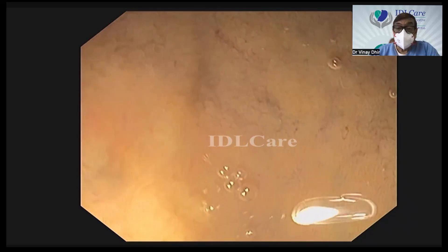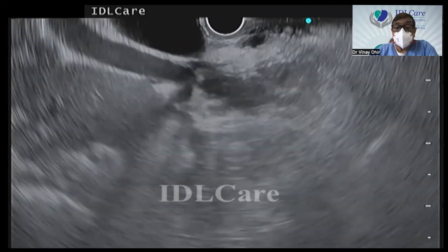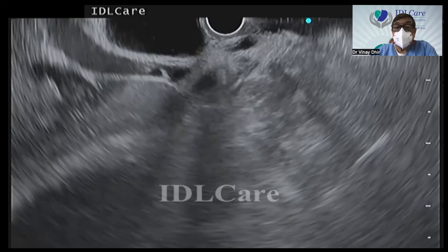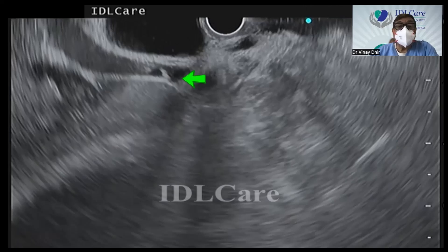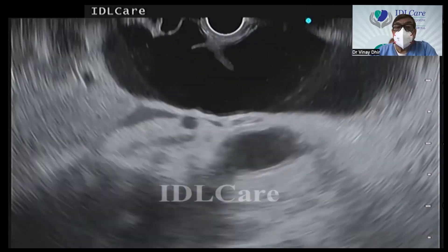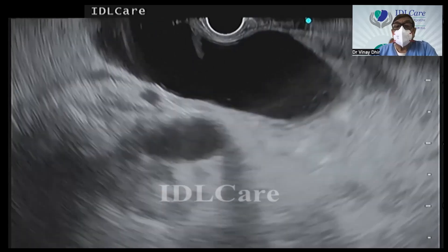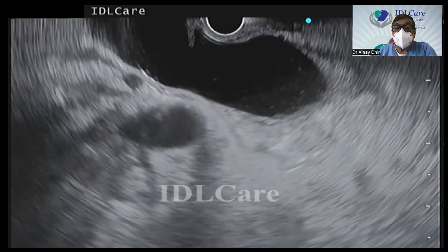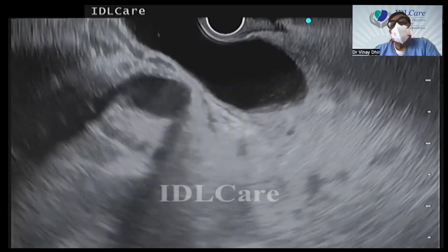Now I am in the first part of the duodenum. You will see immediately you are seeing hugely dilated bile duct — this is the portal vein below, and this probably is the gastroduodenal artery. This is the first look, the liver is here. Then we turn clockwise — see, I'm turning clockwise and you see hugely dilated bile duct again. You are seeing the cystic duct, so bile duct, cystic duct, common hepatic duct, all dilated. Below is the portal vein. Now to go to the ampulla you have to turn your scope clockwise and push a little, not too much.